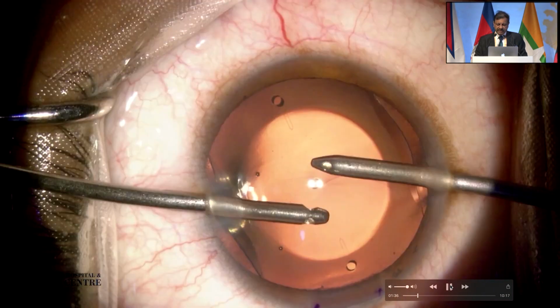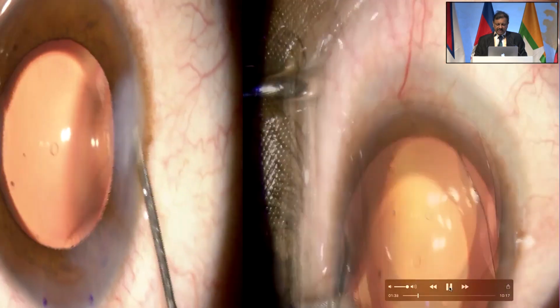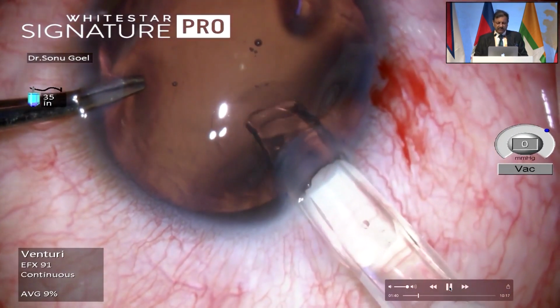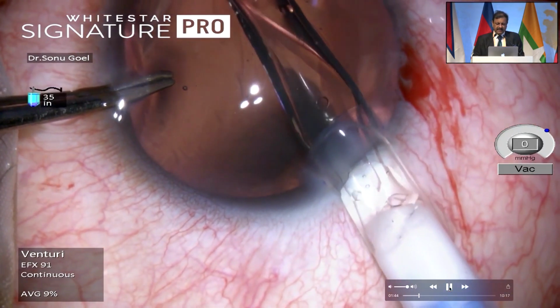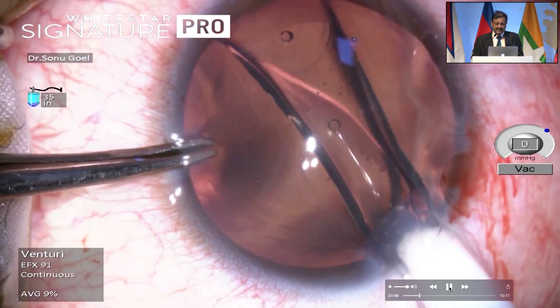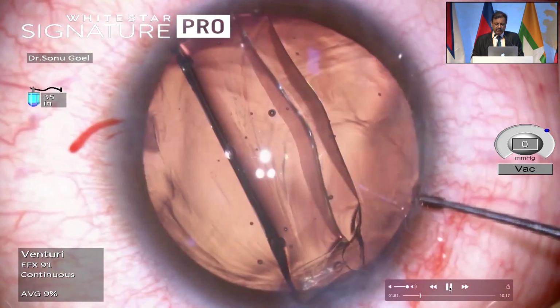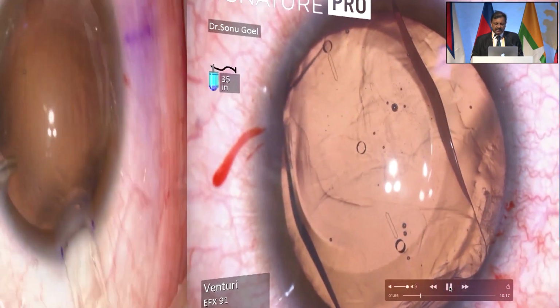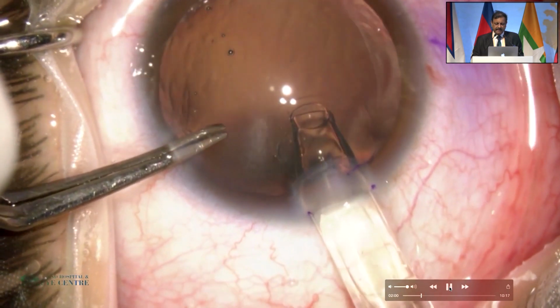And then you can orient a viscoelastic wash. Just watch, this has to be avoided. The cornea never needs to be folded here. So a very gentle aspiration of the viscoelastic. Now just watch, this lens goes inside. I'm observing how the lens is unfolding, and the lens has a tendency to go the reverse. So I just smartly go in with the manipulator and push in, and the lens goes in the right manner.